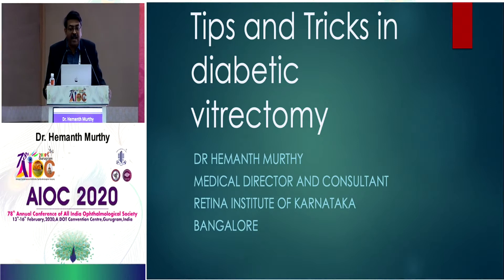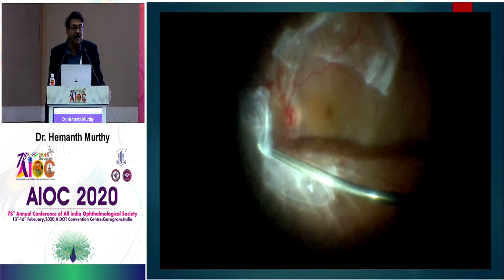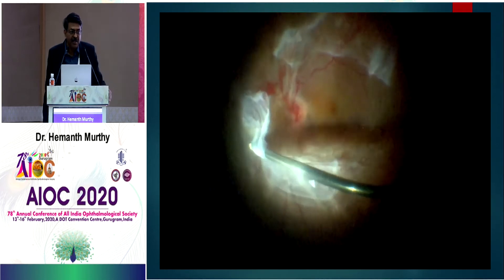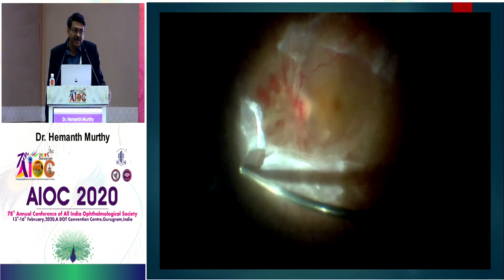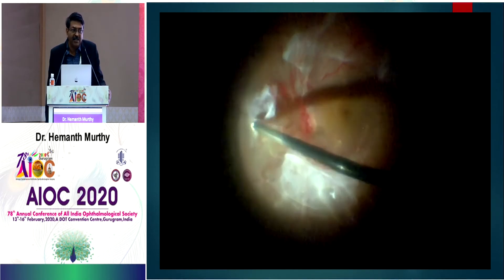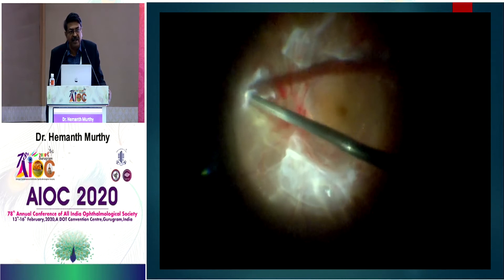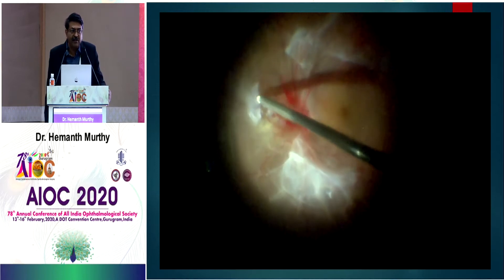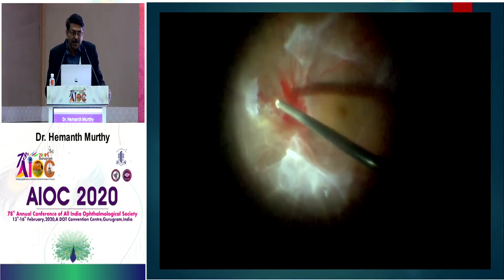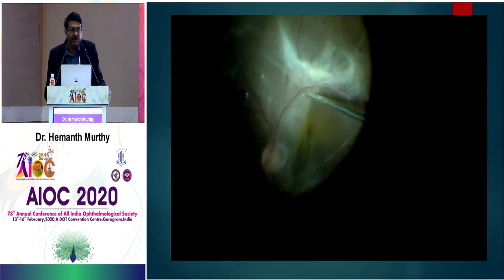I'll be talking about tips and tricks in diabetic vitrectomy. You can see that I'm using the 10,000 bevel cutters — the bevel cutter is very useful. I am using the hydro-dissection technique, where we inject fluid underneath the membrane, and that clears the membrane off the retinal surface. You can then clear it off with the probe, because the opening is closer to the tip.